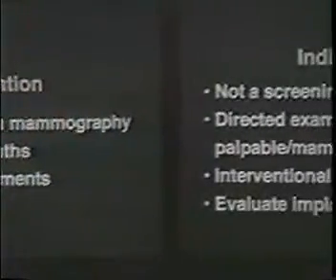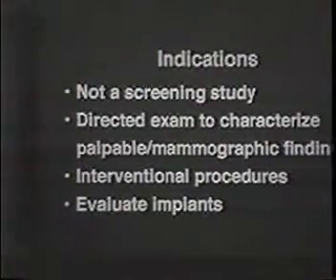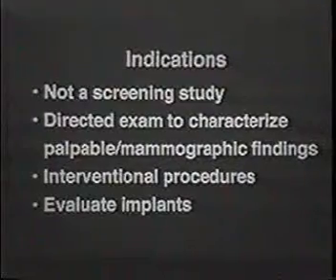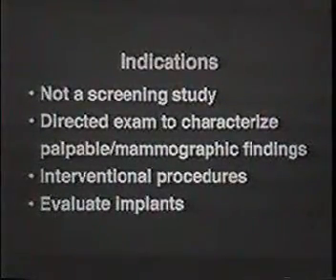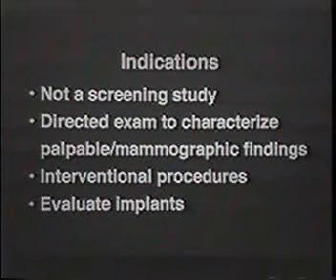Now, in terms of the indications for sonography today, we should start by saying that it's not a screening study, although some radiologists are still using it as a screening study. There's absolutely no evidence that this is effective, and it may actually be detrimental, either by giving a false sense of security or leading to unnecessary biopsies.